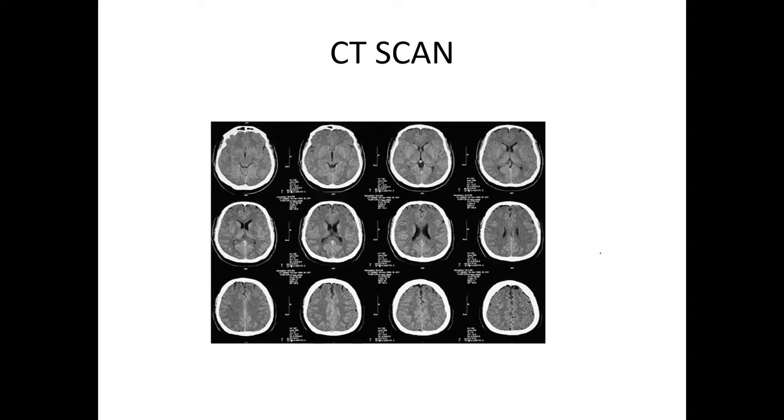You should know that when you do a brain CT scan, the report or how you describe your lesions, you use densities. You remember when we talked about X-rays, we use opacities.